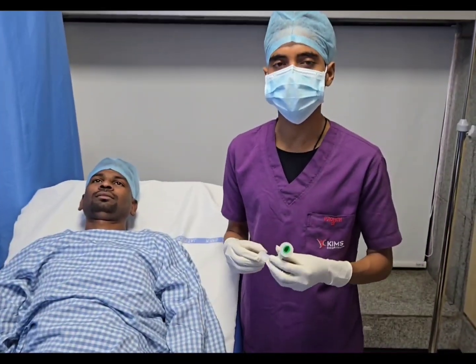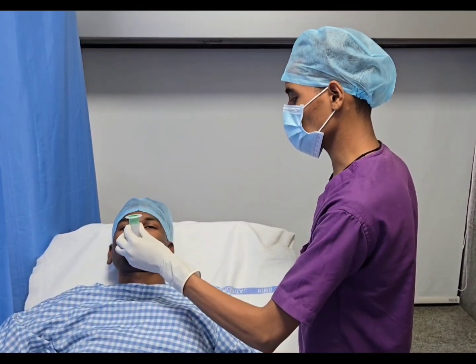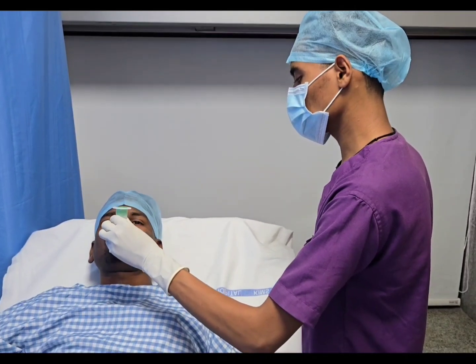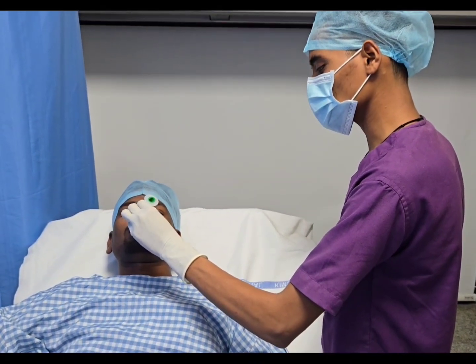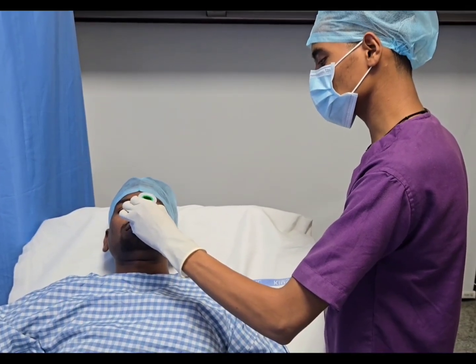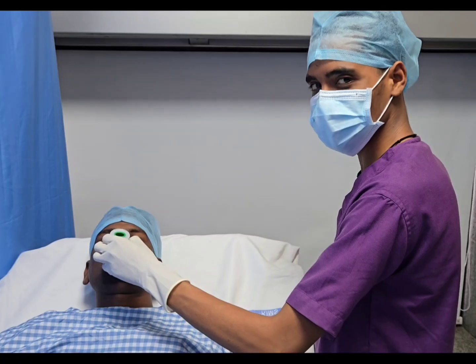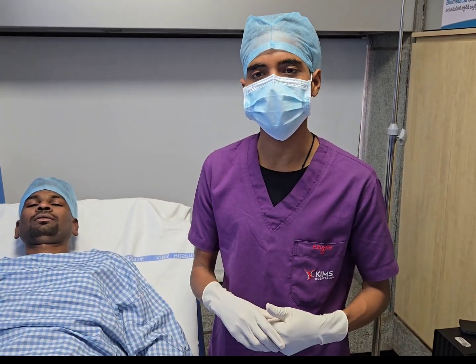Steps of insertion: how will we insert the oropharyngeal airway? Hold the tip of the OPA facing the roof of the mouth and gently insert it into the mouth. Slightly rotate it 180 degrees so that the concave shape reaches the posterior oropharynx. This is how we insert the oropharyngeal airway.